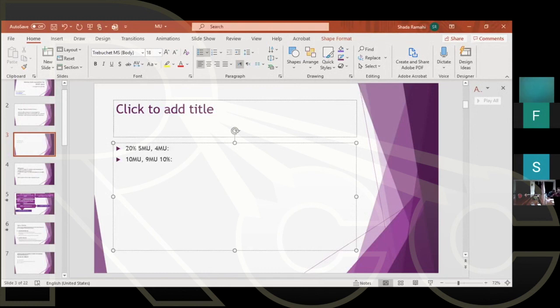Because it's a small number divided by a smaller number. In this case I can say the difference is in absolute units. So I can say the difference is 1 monitor unit. Here the difference is 1 monitor unit. So you can have your clinical protocol to say we accept no more than 5%, for example, or no more than 2 MU difference or 3 MU difference, to give room for such scenarios where you have one field that is contributing very minimal monitor units. This is very important. Thank you very much.